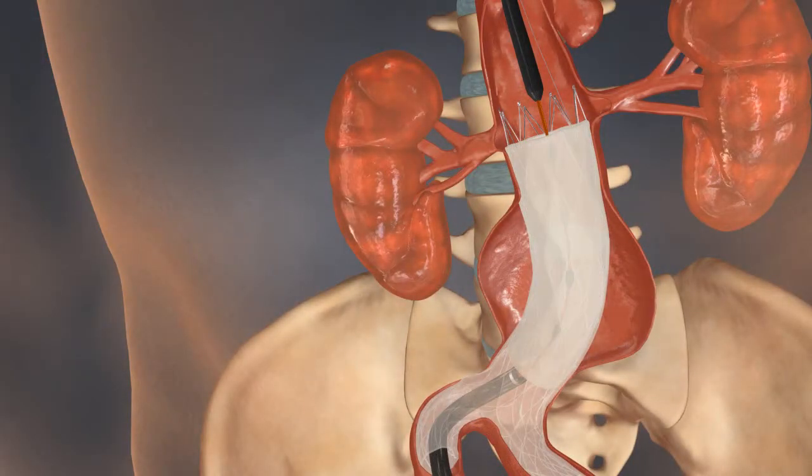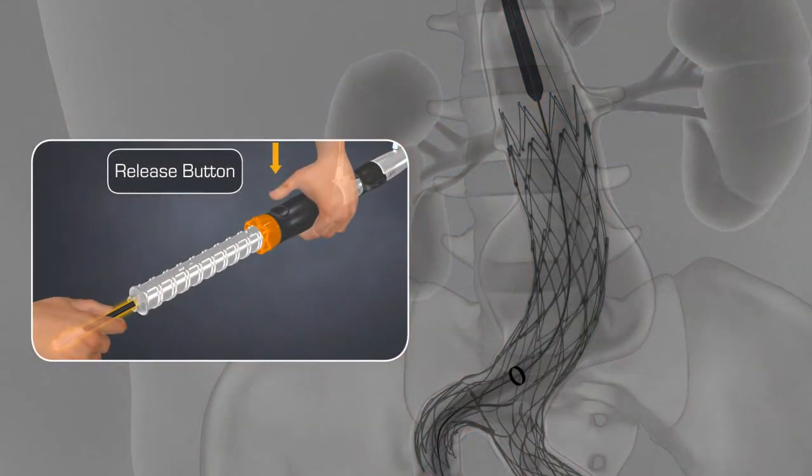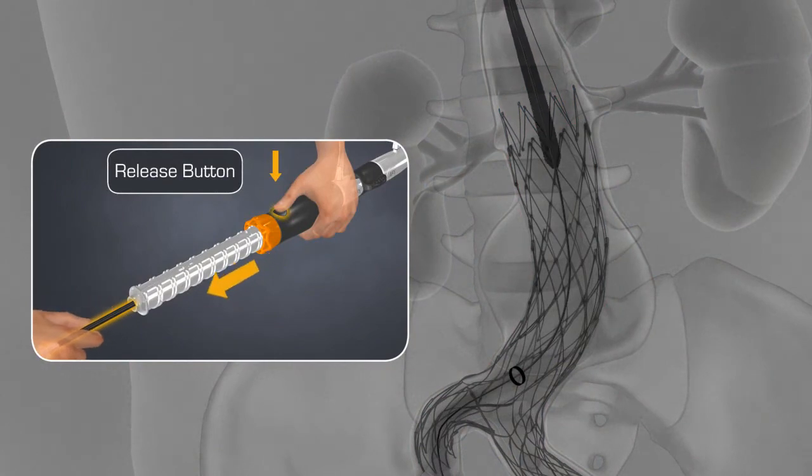After complete deployment of the aortic extension, press down on the release button and pull the inner core back in through the introducer sheath until it stops.